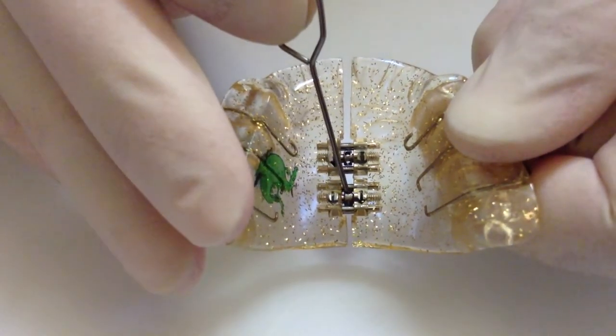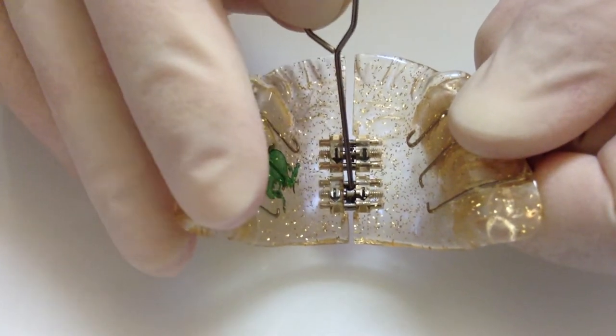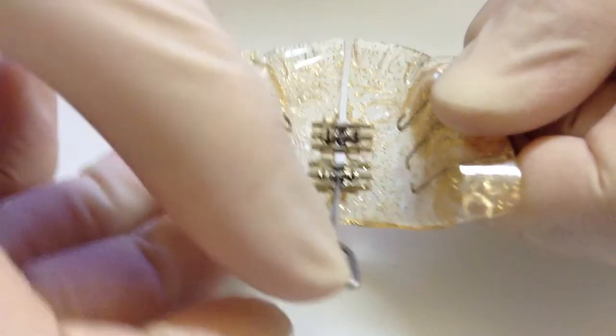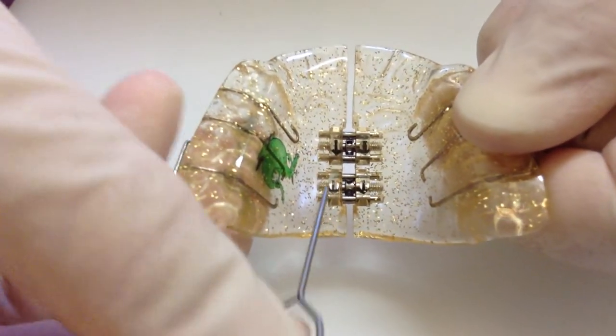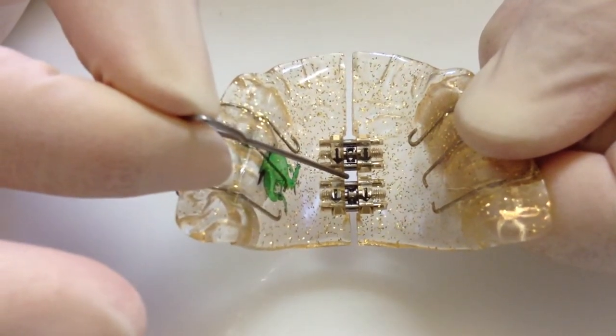Moving on to the second part of the plate, place the key into the hole, again turn it until you can't turn it any further. Remove the key like that, and again you should be able to see the hole there.